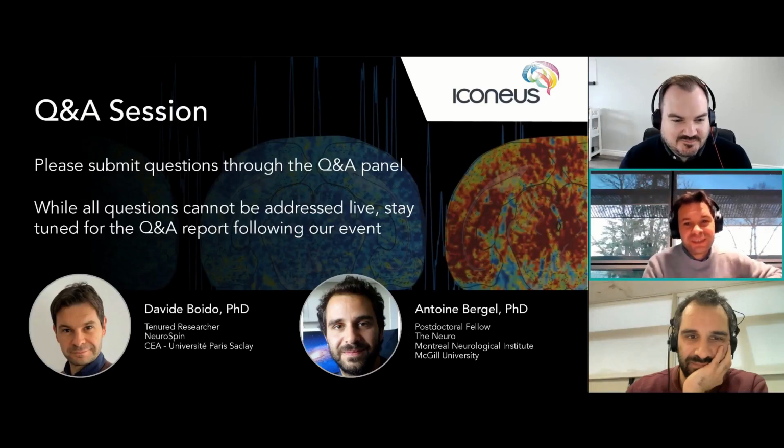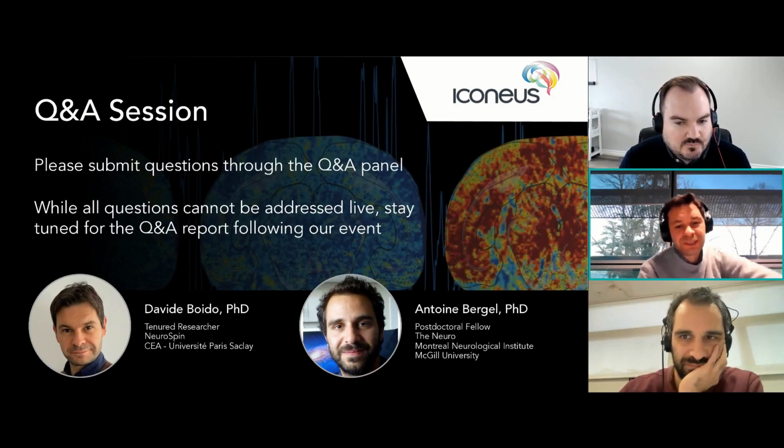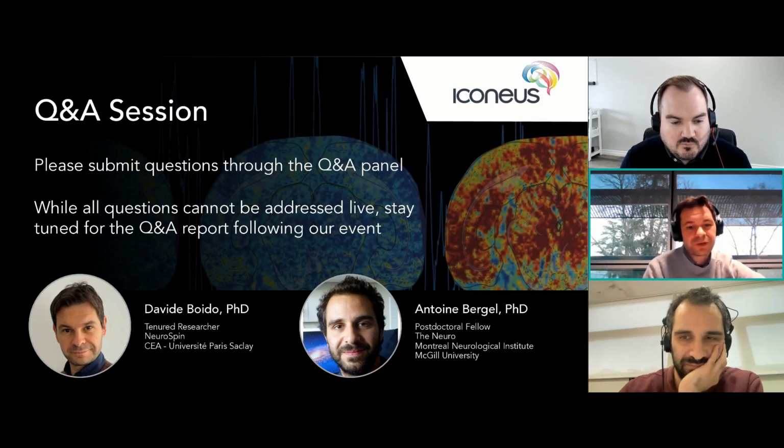Our first question: Davide, you mentioned that the choice of the olfactory bulb was unfair for BOLD fMRI. Maybe you could elaborate on that. Yeah, it's just because it's both olfactory bulb and mice. So it's a very, very tiny volume. We are talking about 2 millimeters square for imaging. And so it's really tricky to make a shim properly, in particular if you are working with an ultra high magnetic field.